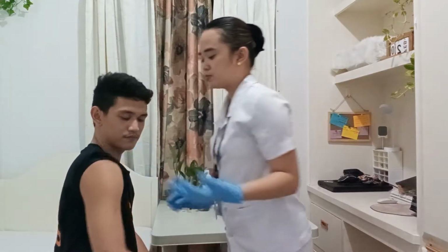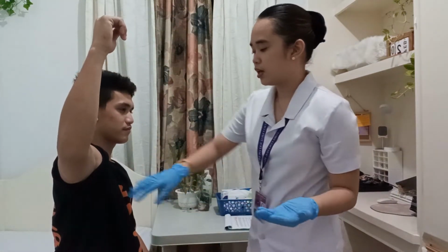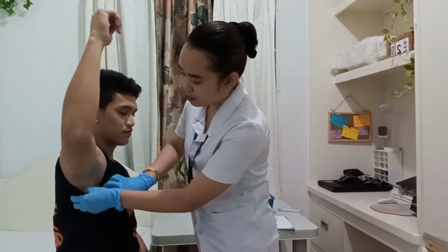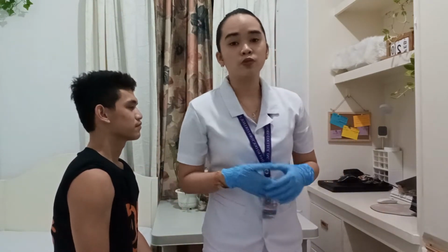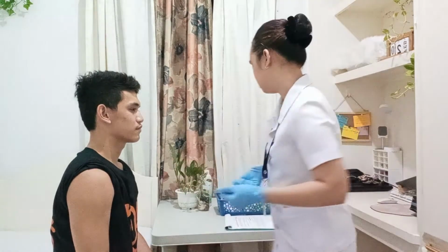Okay, can you raise your arms, please? Okay, so per inspecting, there are no lesions or perspiration on the armpit of my patient. Now I'm going to pat dry the axilla of my patient using a tissue.